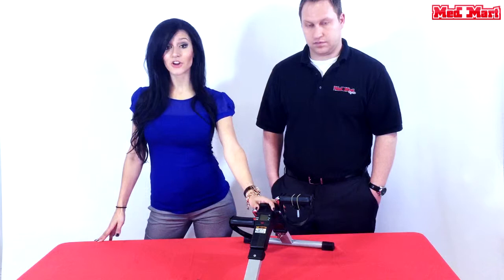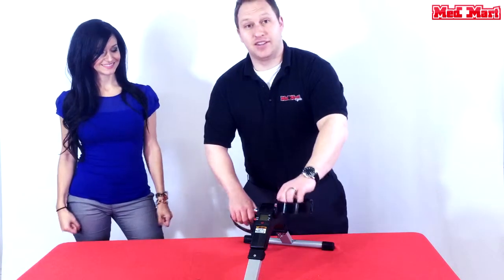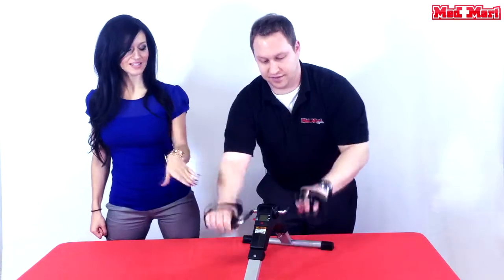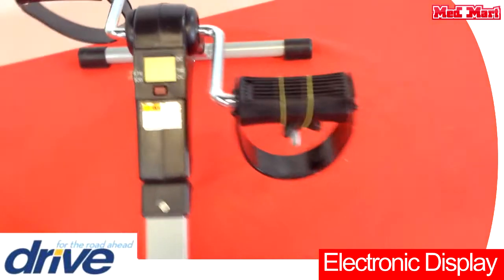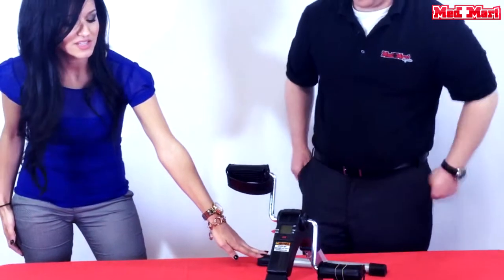It can be used for your arms or your legs. Dave is going to demonstrate using it with his arms. If we can't make it to the gym, you've got to be able to do something at home. The electronic display is going to show you how many calories you've burned, your exercise time, your revolution count, and your revolutions per minute.